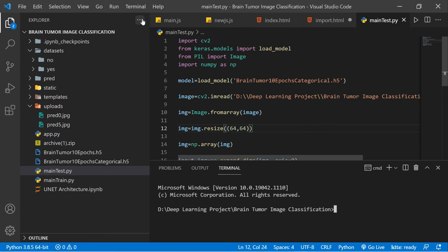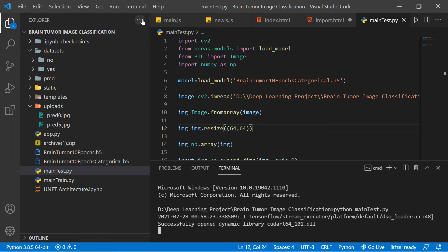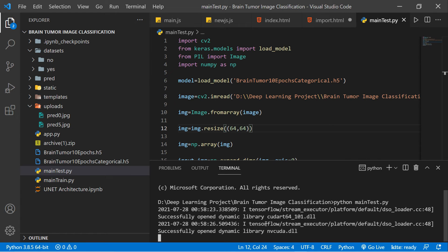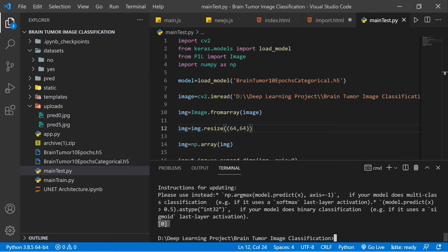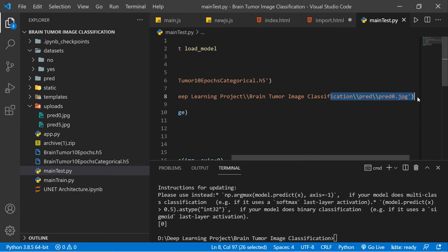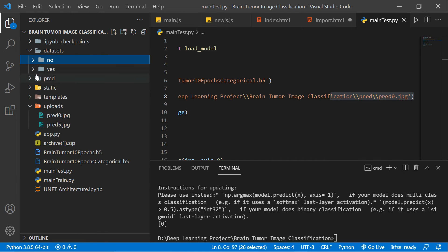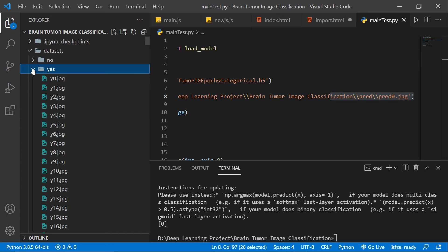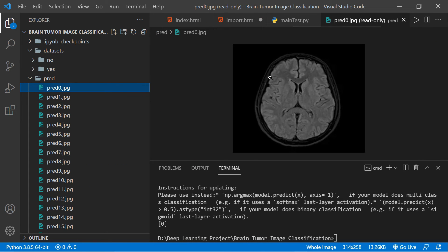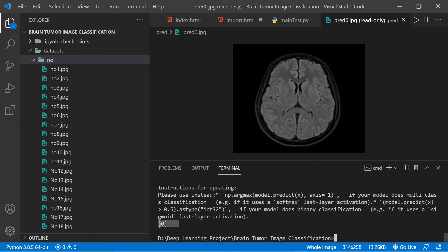Let's run the code: 'python main_test.py'. It loads the model — just take a few seconds — and the output is zero. Class zero means no brain tumor. Looking at the prediction, class index zero corresponds to the 'no brain tumor' class, so the output is zero for an unaffected brain scan.